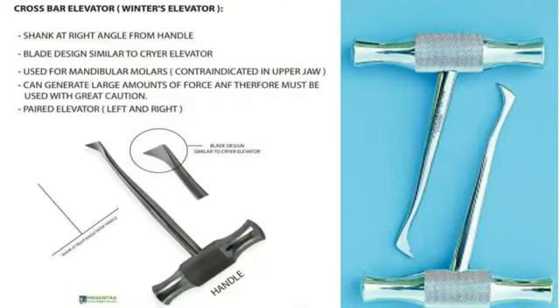It can generate a large amount of force and therefore must be used with great caution and not in the upper jaw since its bone is spongy and weak. It's also called Winter's elevator.